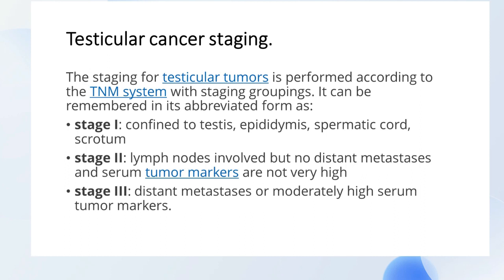So make it a point that whenever you are dealing with a testicular ultrasound scan, make an extra effort to look for distant signs if you suspect that there can be cancer of the testicles.